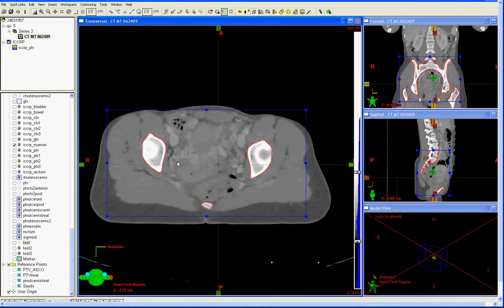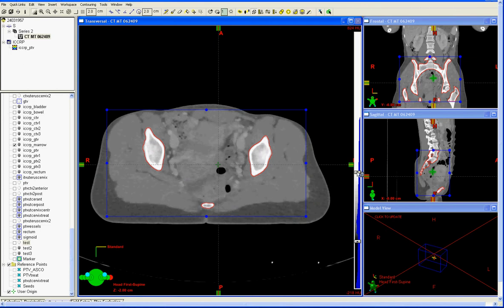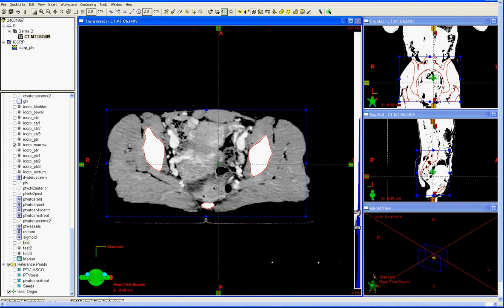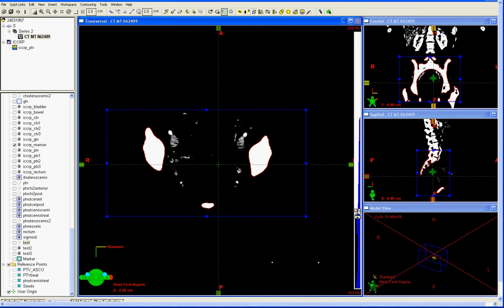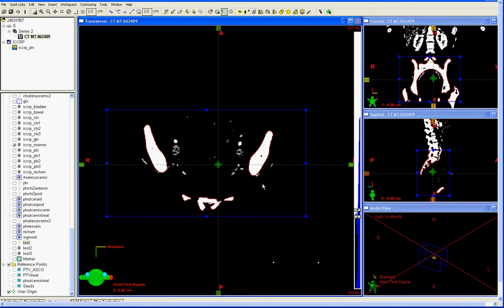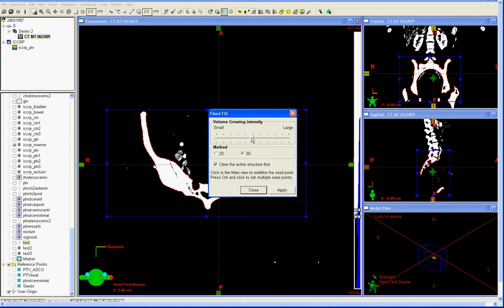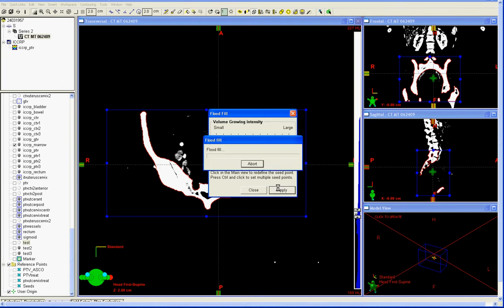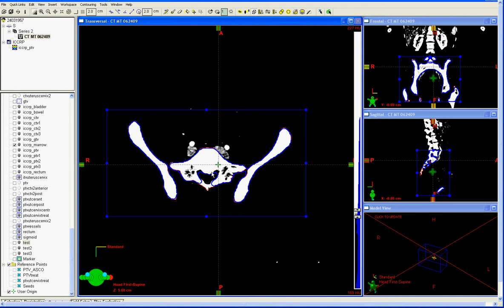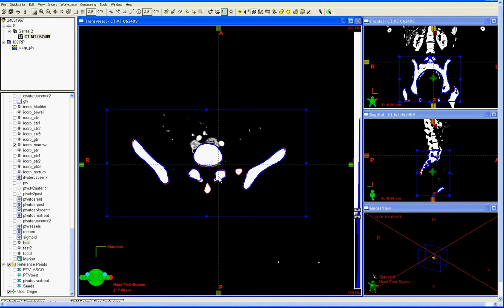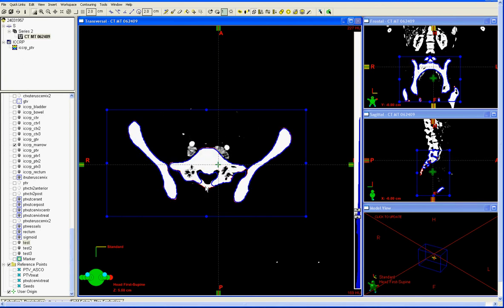Now that the volume of interest is defined, we can window and level the scan to isolate the bone. Here we'll use a Hounsfield unit setting of about 220 to 227 or so. We'll choose an area of the bone that's fairly dense, like the medial ilium. We can click on this tool, click inside, and this bar may need to be adjusted depending on the patient. We'll start with a level of 40 and click apply. That should fill in most of the bone and does a pretty good job of contouring inside the bone. There may be some post-processing and editing needed to fill in some of the bone that is missing, but overall it does a pretty good job.